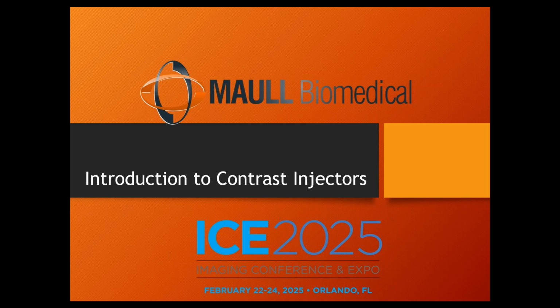So what contrast injectors do is they basically make it possible for blood vessels to show up on images. Perfect, thank you. Now, does anybody in here have absolutely no idea how imaging works as far as taking an X-ray and how X-ray images are produced? Okay, so everybody has some idea of that.